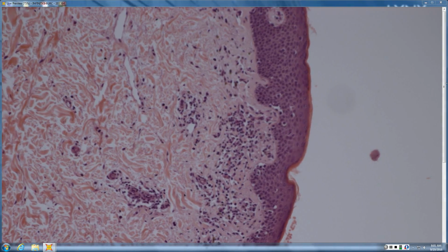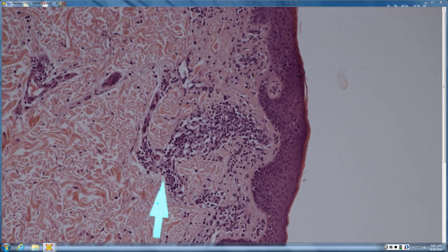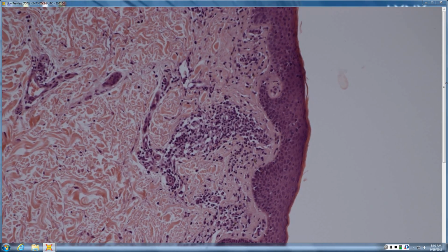And when you look at the infiltrate around the vessels, is there a lot of infiltrate on the underside of these vessels, or is there more infiltrate to the top of the vessel, but really not much infiltrate under the vessel? That is your bare underbelly sign.